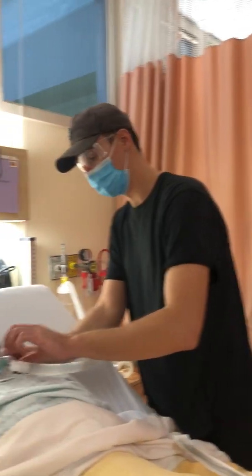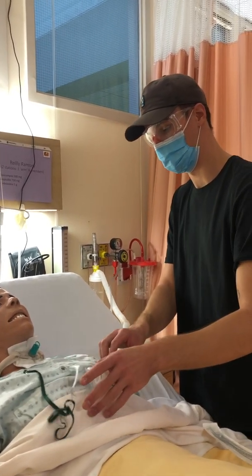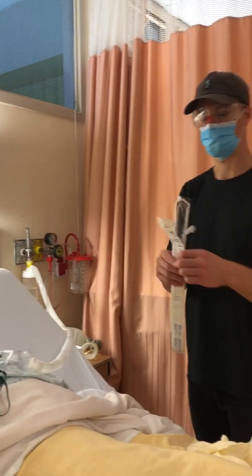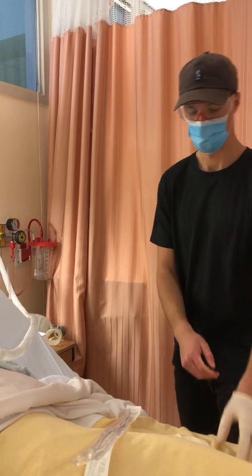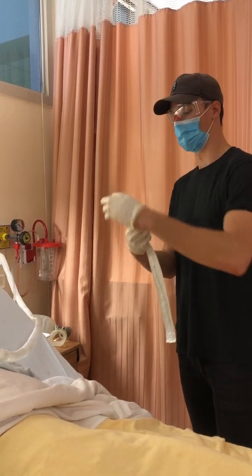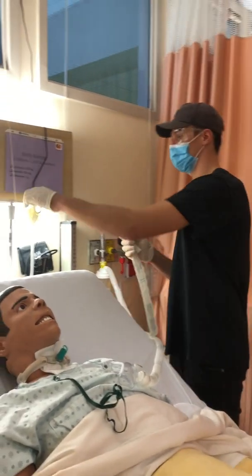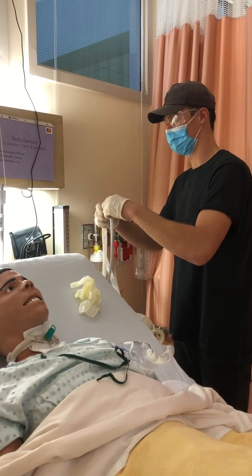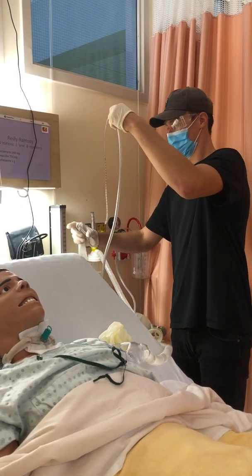I'm going to take this off, and make sure this doesn't fall off. And then I'm going to perform some hand hygiene here, and then put some gloves on. And this wouldn't be open, I'd open it. Again, make sure that the suction is on and it's between 80 and 120. And then I take the glove off here, attach, and then I will keep the tip sterile here.